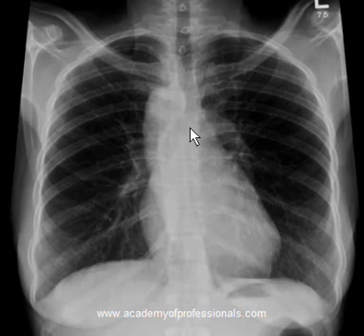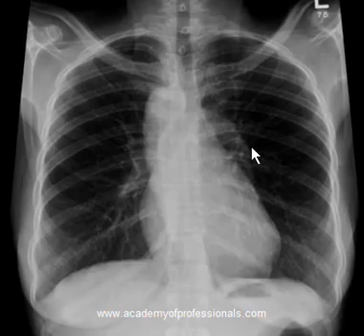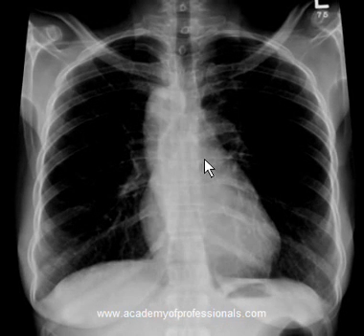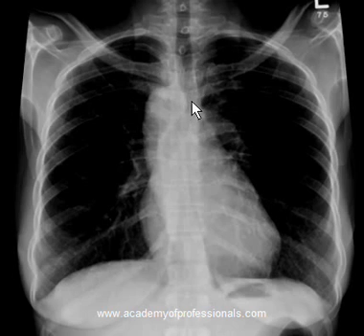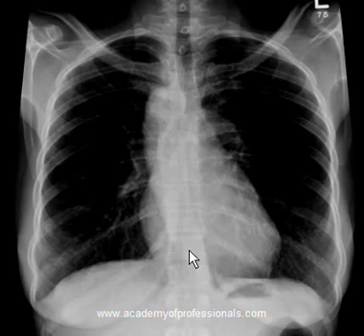Now this is an interesting x-ray. If you look at it, the arch of the aorta is missing from its usual place on the left side, which makes the left pulmonary artery very clearly visible — unusually clear. And if you notice, the trachea is pushed towards the left-hand side instead of the right, and there is a density that continues down towards the diaphragm, moving towards the middle of the spine as well.